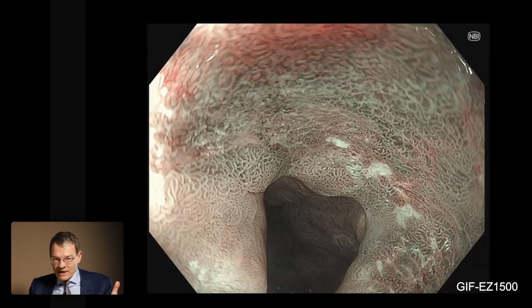But when you compare to the first image, it was not well visible, and I think this is an example. The filters or the post-processing features helped somehow to assess the lesion, the Barrett's, but the most important here is also using a cap and new technology.